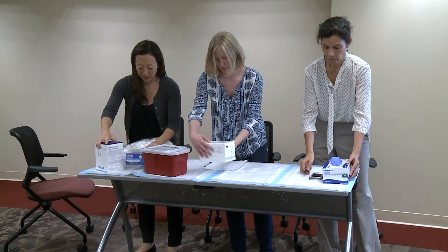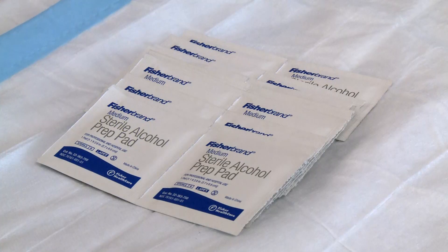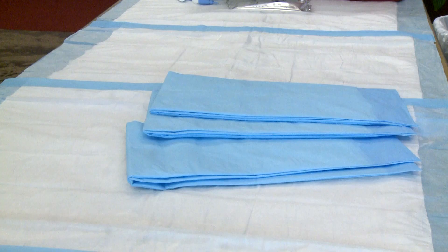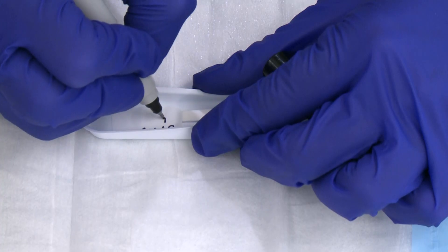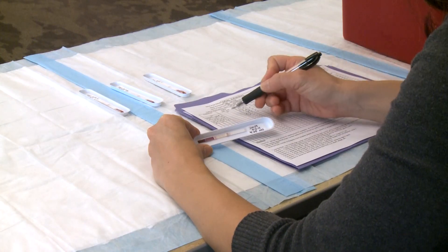The kit does not contain the other supplies you will need, including lancets, cotton, alcohol swabs, gloves, sharps containers, absorbent underpads, marker pens, trash bags, a watch or timer, and recording forms.